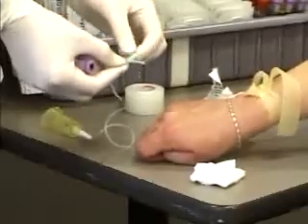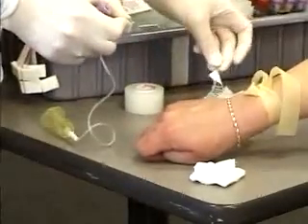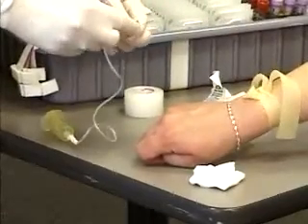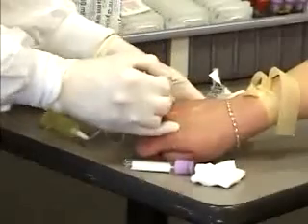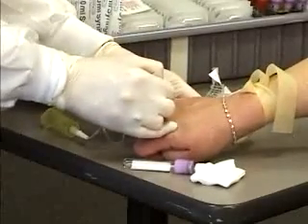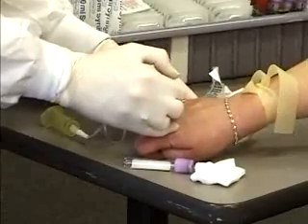Pinch up your wings, take the top off, and once again make sure you have the bevel up. You want to anchor the vein and enter it in one swift, fluid motion.